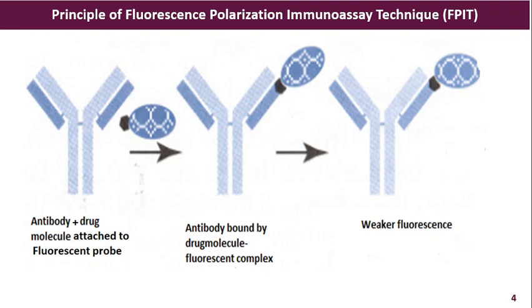And the variation will be so huge that you can immediately make out that the polarization shown by the antibody complex with drug molecule fluorescent complex indicates the sample is negative for the drug that is being investigated.